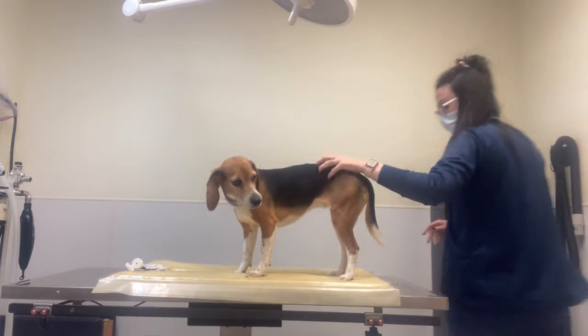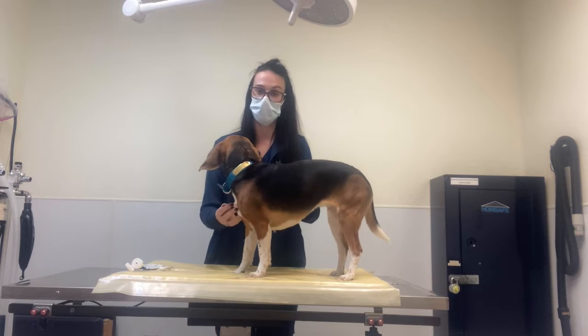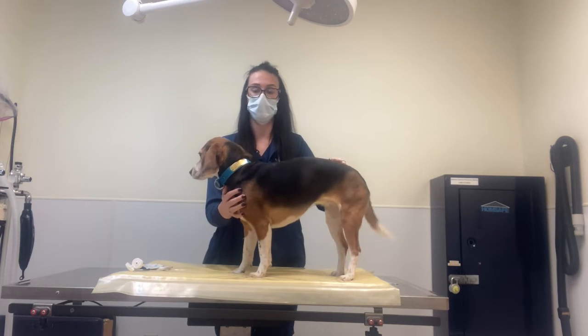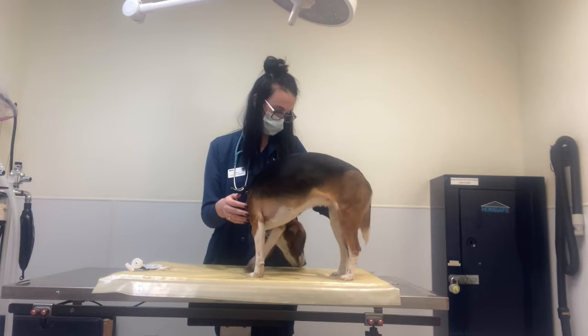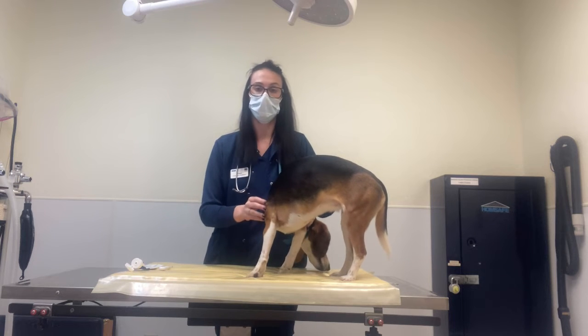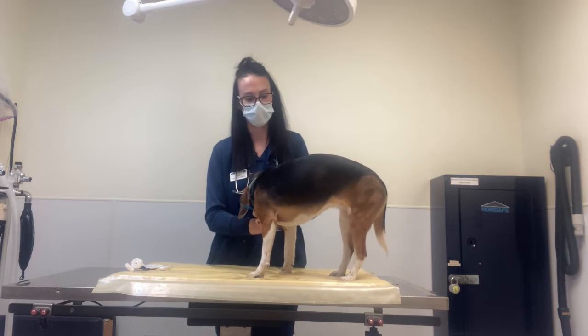Okay, so this is TPR on a dog, and this is Zoe. She is my beagle. She's the bestest girl. So same thing with cats. TPR, pulse, temp, and then respirations. So same thing kind of applies. Zoe's a small dog. She's a little easier to see as far as listening to the heart and lungs.